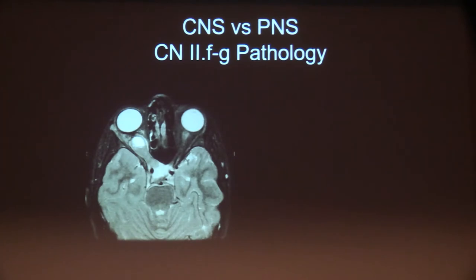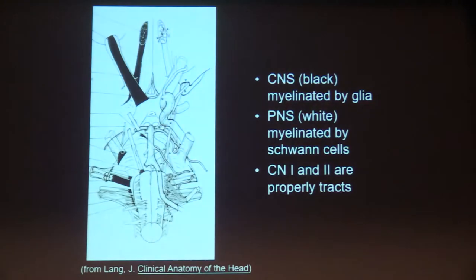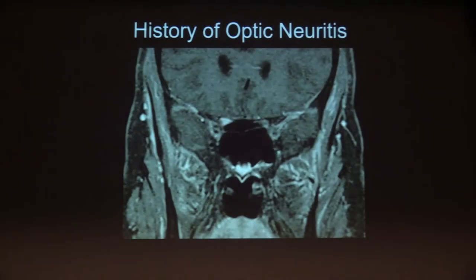This is to emphasize that a mass of the optic nerve cannot be a schwannoma through the foraminal segment — this is an optic nerve glioma, part of the central nervous system and centrally myelinated.